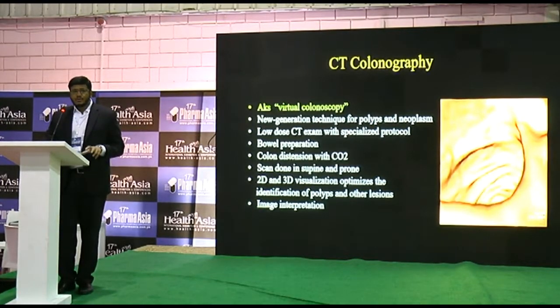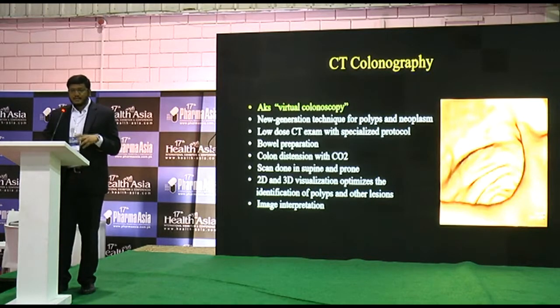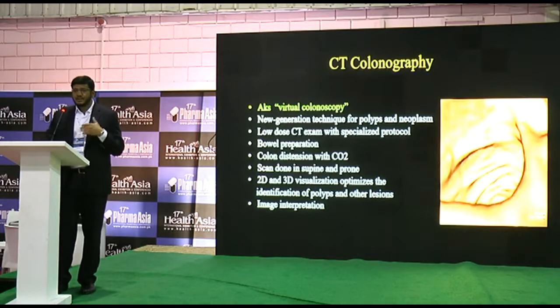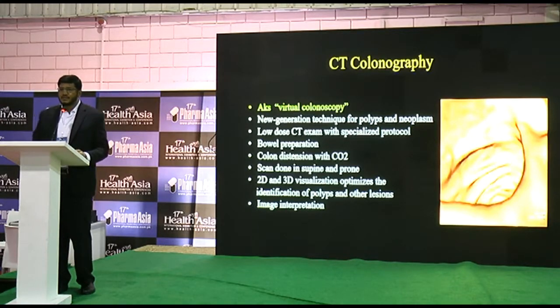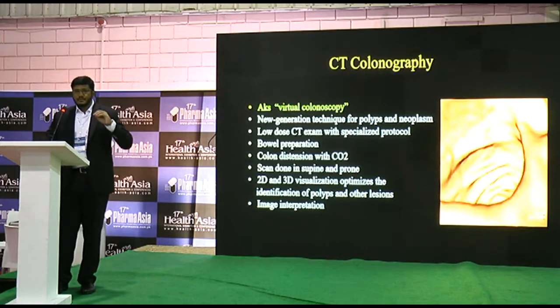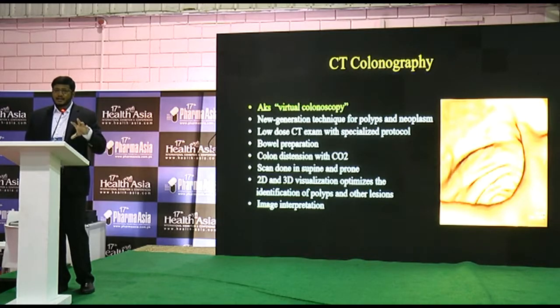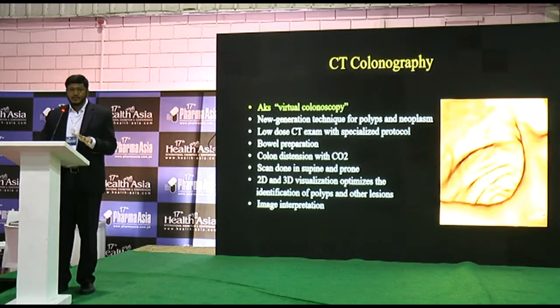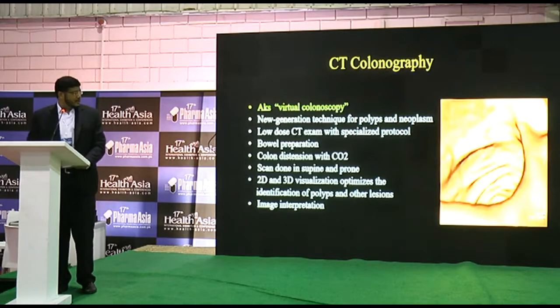In the specialized protocol, there is a preparation of the patient in which, one day before the exam, the patient is given a colon cleaning agent to completely evacuate the bowel. On the day of the exam, the patient comes into the CT room and a small bore rectal tube is passed, and then the colon is distended with carbon dioxide. Then the scan is performed in both supine and prone positions, and the data acquisition is read with 2D and 3D volume software by the radiologist.